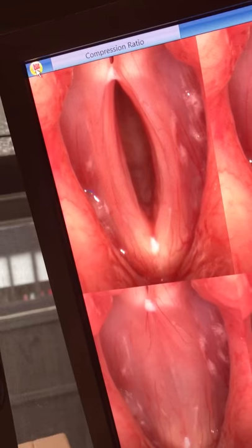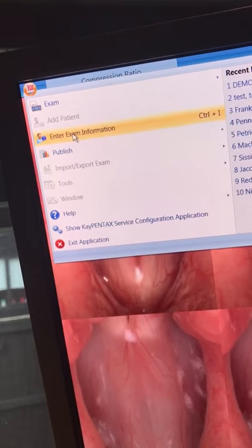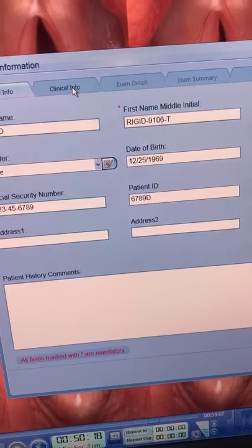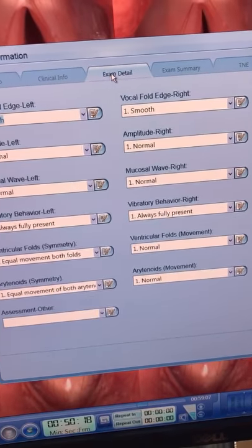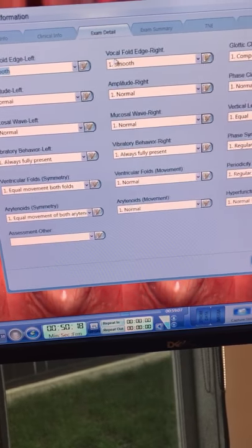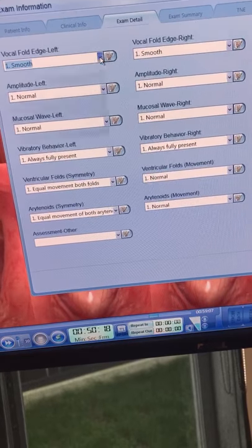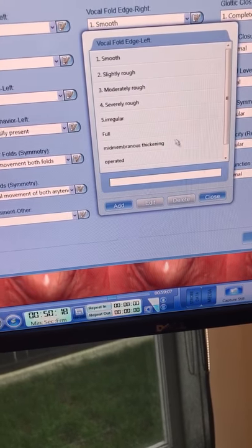Really importantly, up on the left hand side there's a little circle — what we call the global menu — where we can enter exam information. We've got the patient info — information that was placed into the system a bit earlier. Clinical info. Exam detail. We can see we've got some drop down boxes here: vocal fold, each left and right, and so on. You might not like these drop down menus, so you can adjust them — you can add or delete one of these options here.